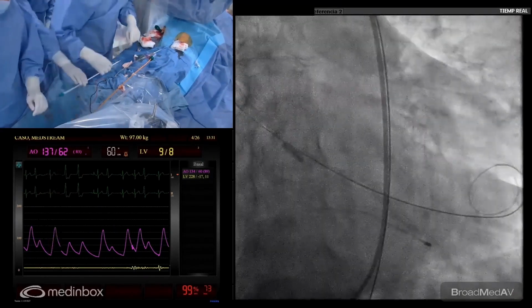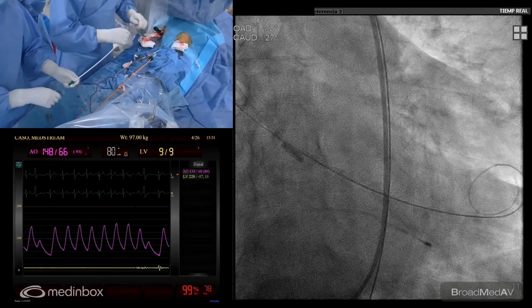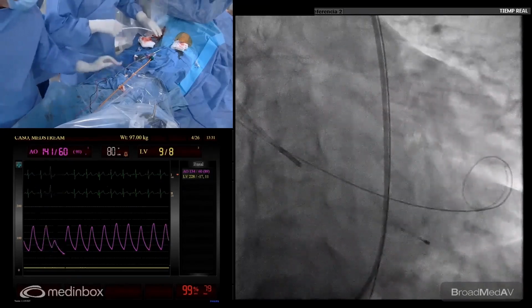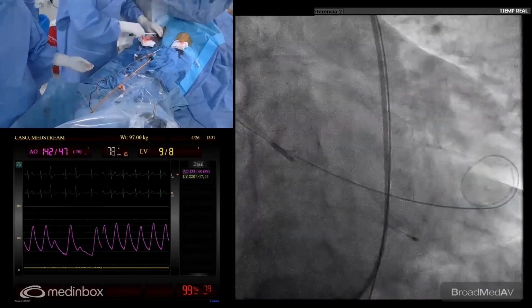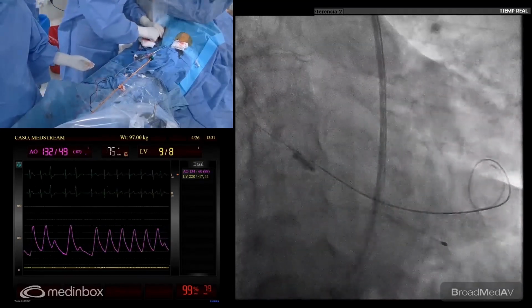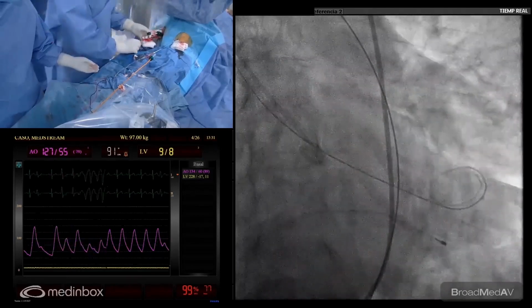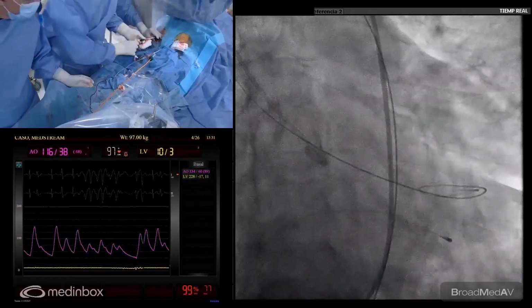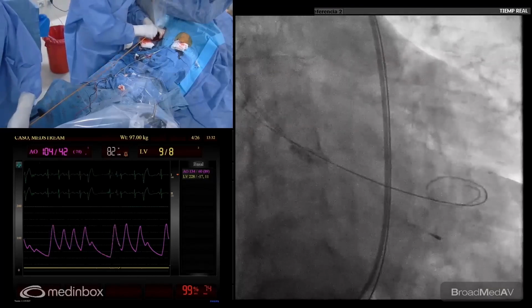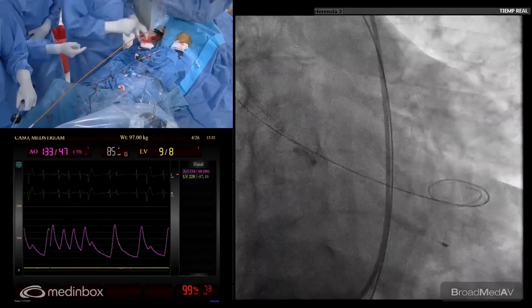Some people don't expand the dilator with the 18, as we were talking about yesterday with a group. But we always increase the size of the introducer with the 18, so the valve can navigate easier. Give me the sheath, Franco. Okay, Fernando. So let's go here. We will check the valve before going out of the introducer.